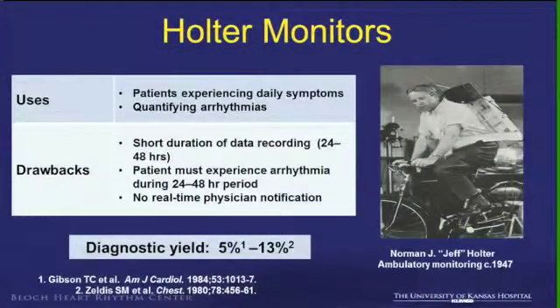To start off, the Holter monitor, as you probably already know, Norman Jeff Holter invented this back in 1947. The original Holter monitors weighed between 80 and 85 pounds, and they were worn on your back like a backpack. The Holter monitors at that point were revolutionary because they allowed patients to go about, as Dr. Holter said, their regular business, although you can see it would probably be very difficult to go about your regular business with that pack on your back.